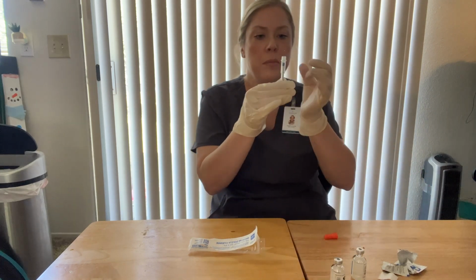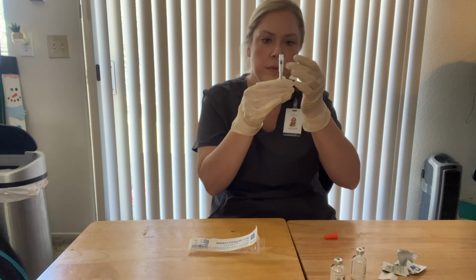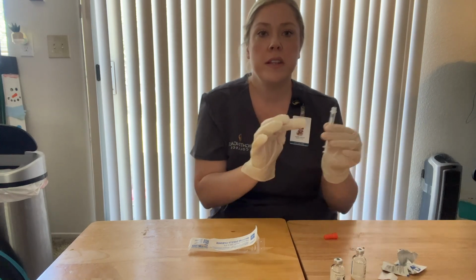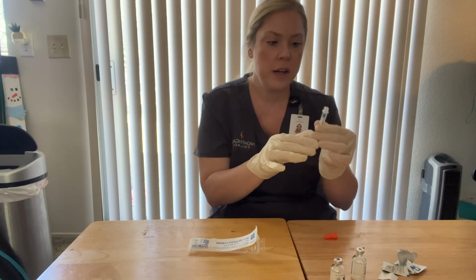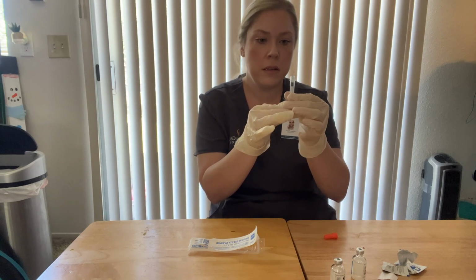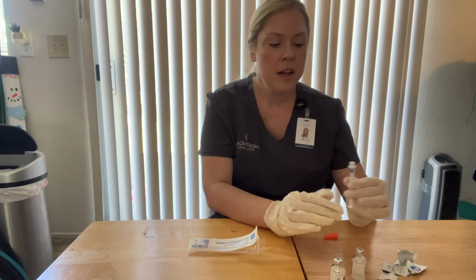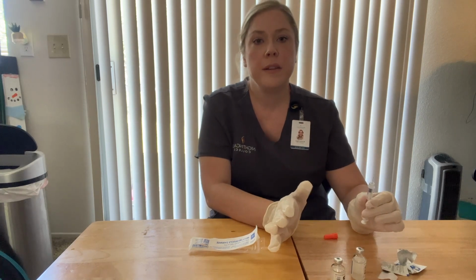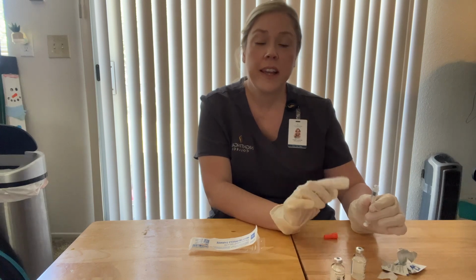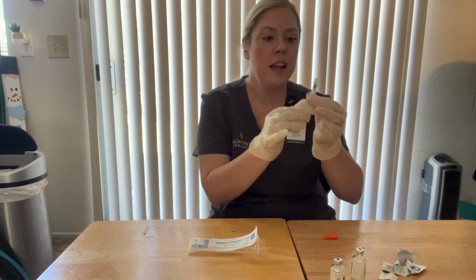And I'd want to tap the air bubbles out. And then I would want to compare this regular insulin to the MAR again, making sure I had it correct. And everything looks good. So then I'd want to go ahead and check the syringe to find that 12 units on it.